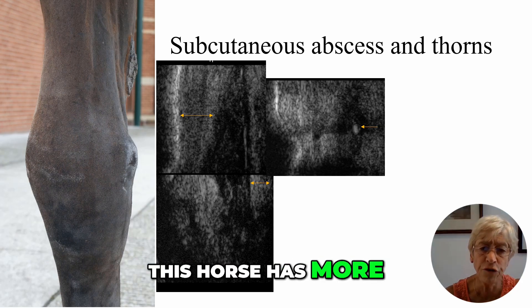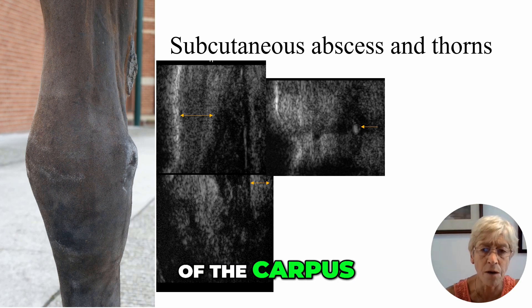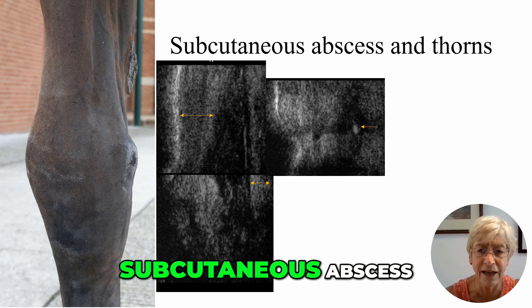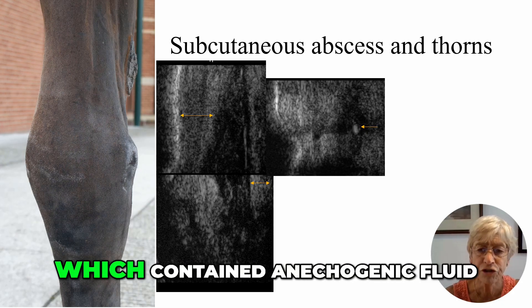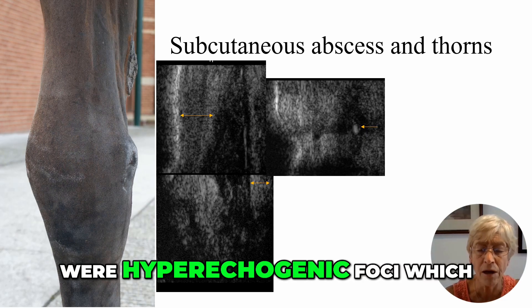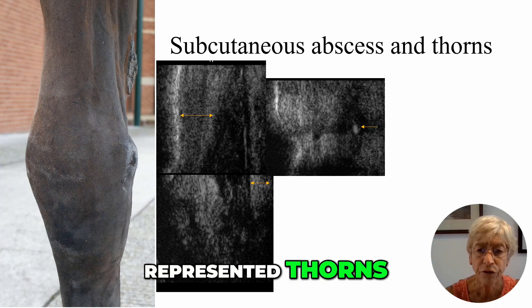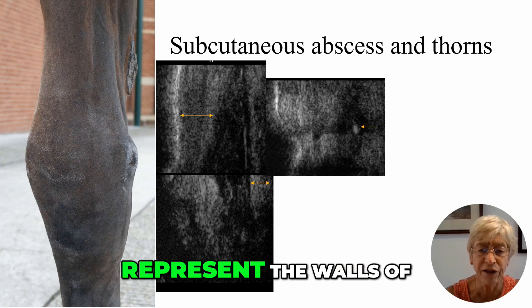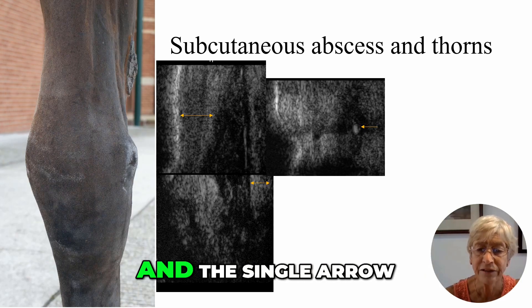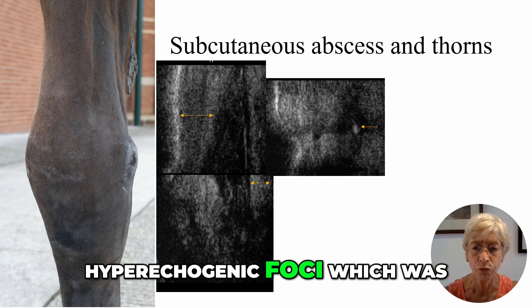This horse has more diffuse soft tissue swelling on the dorsal aspect of the carpus. Ultrasonographic evaluation confirmed that this was a subcutaneous abscess, which contained anechogenic fluid, within which were hyperechogenic foci, which represented thorns. The double headed arrows represent the walls of the abscess surrounding anechogenic or black fluid, and the single arrow represents one of the hyperechogenic foci, which was a thorn.